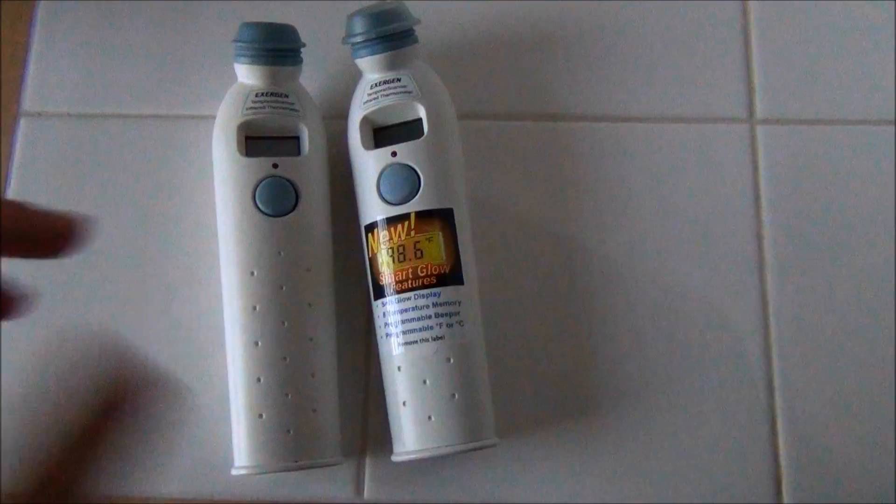Hey everybody, it's me Courtney from Courtney Sweets. Today I just wanted to show you Exergen's two thermometers.